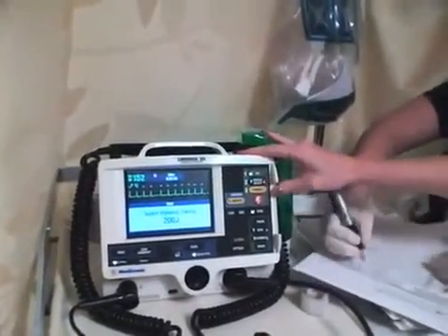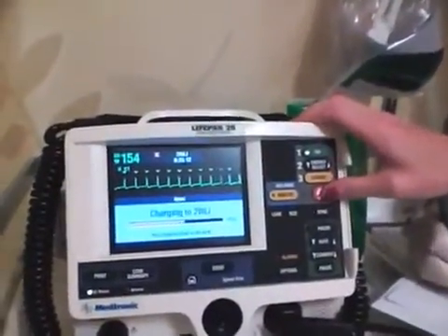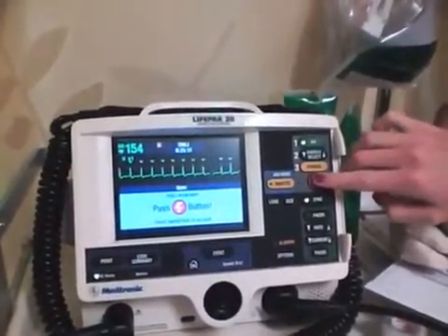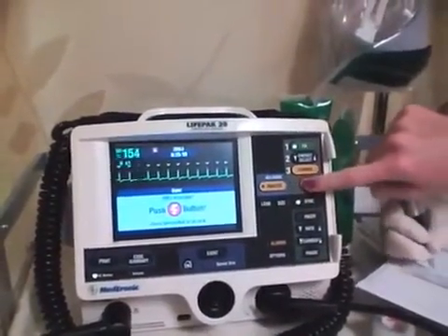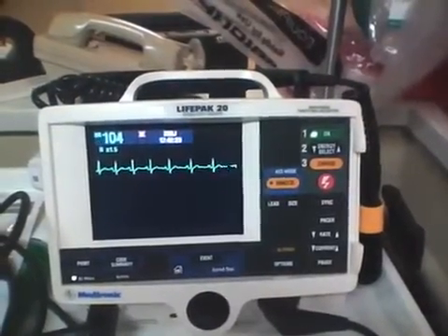Most patients who are converted from atrial fibrillation to normal sinus rhythm can be discharged from the hospital. For elective ED cardioversion, the patient's episode of atrial fibrillation must be less than 48 hours duration, or the patient must be on some form of ongoing anticoagulation.